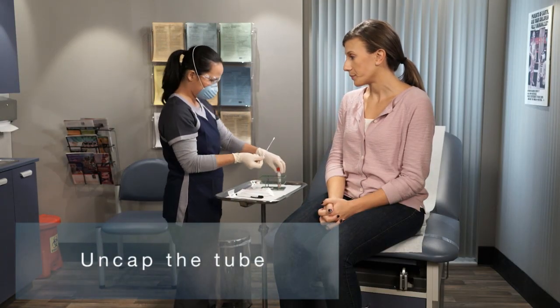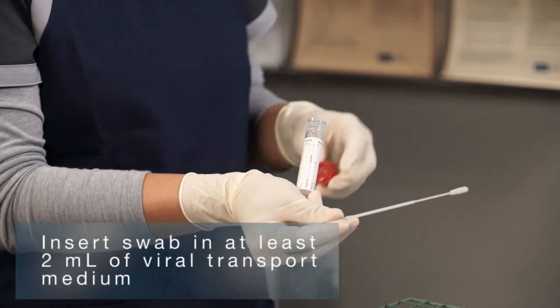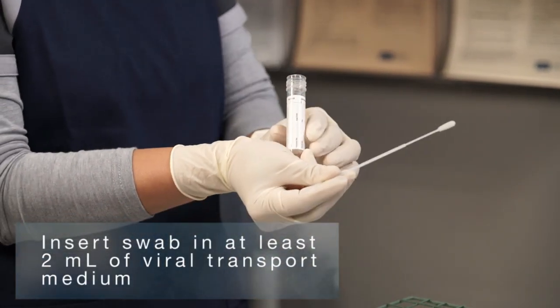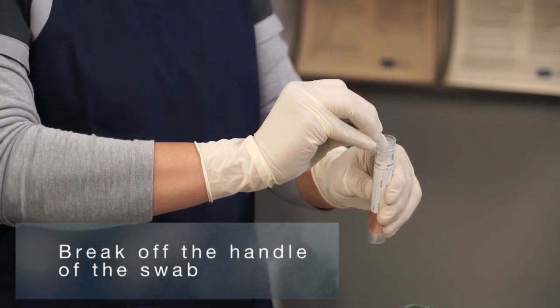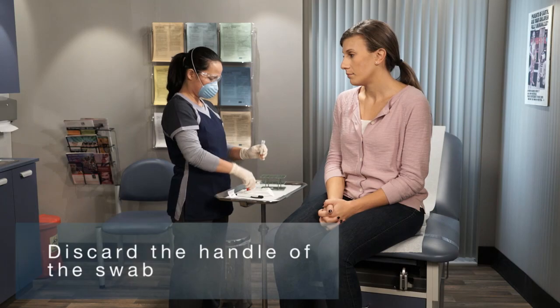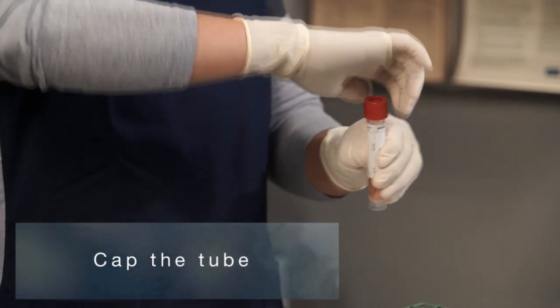Uncap the tube. Insert the swab in at least 2 milliliters of viral transport medium. Break off the handle of the swab and discard it. Cap the tube, leaving the tip of the swab in the tube.